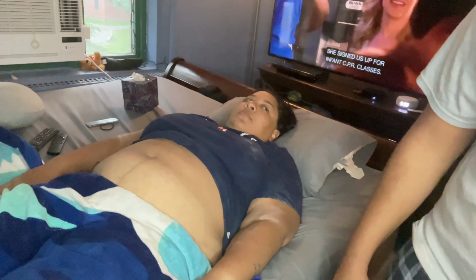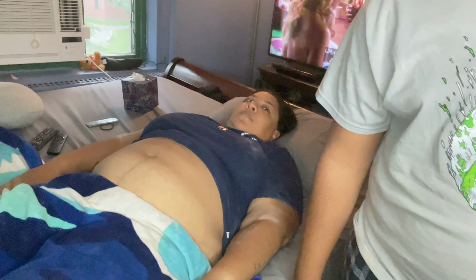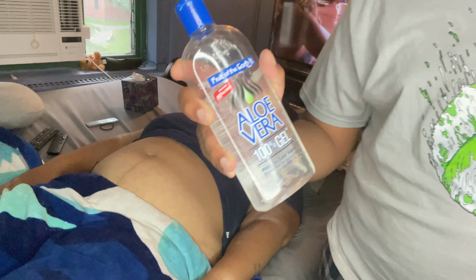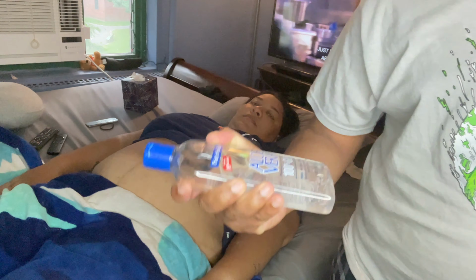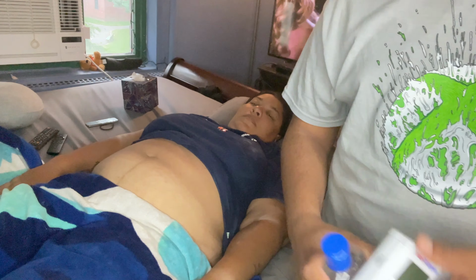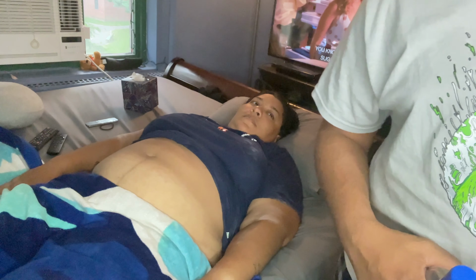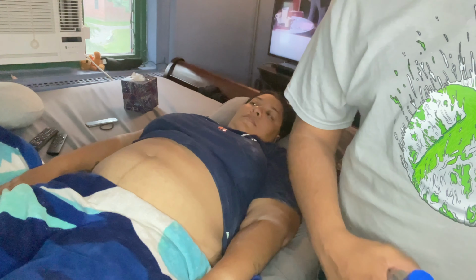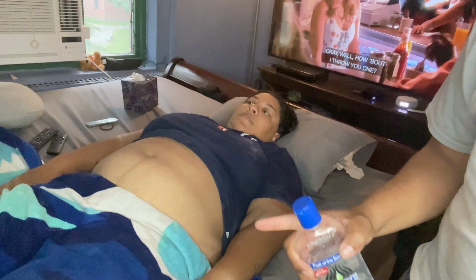All right, guys, we're gonna do the Doppler to show y'all how it works. So we got aloe here. They do sell the stuff for the Doppler, but you go with aloe, it still works. We're gonna do two things. We're gonna look for my wife's heartbeat first, and then we're gonna look for the baby's heartbeat so y'all can tell the difference. Sometimes it may take a little bit to get both, but just be patient.